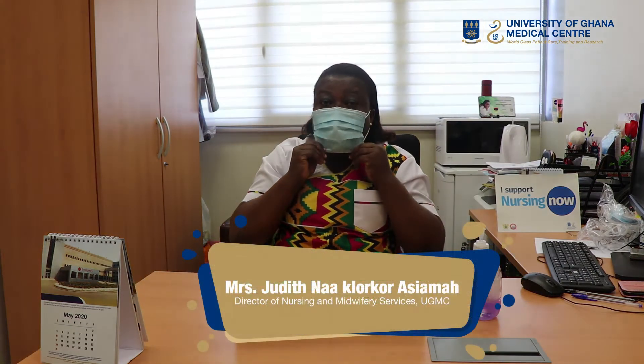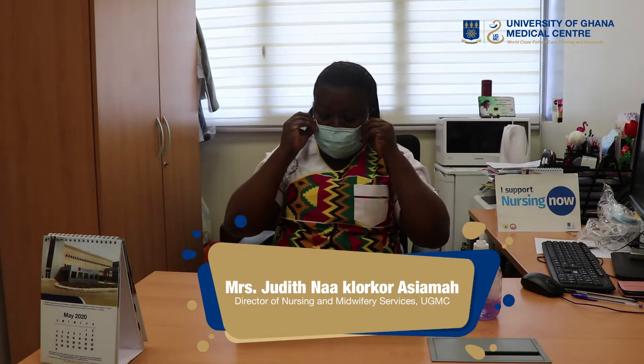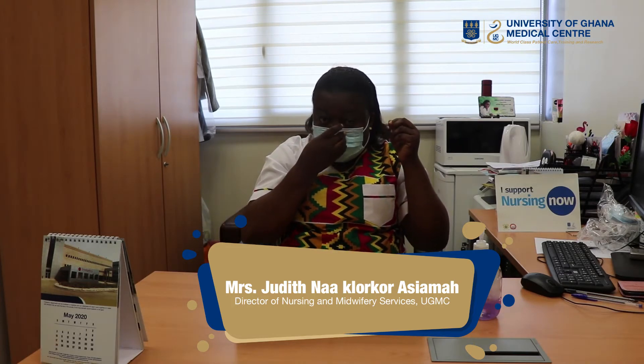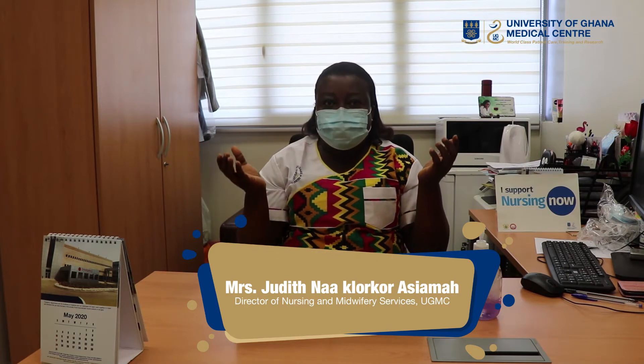Now I have to pull it to cover my chin — very important. Then I'll press the string to hold the nose. That is the loop face mask.